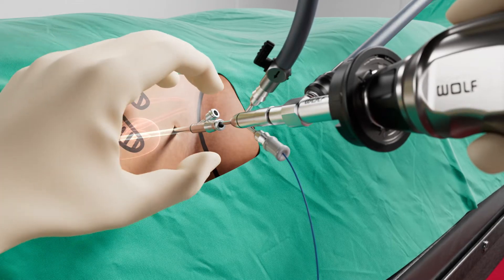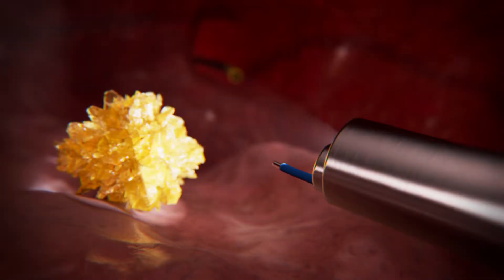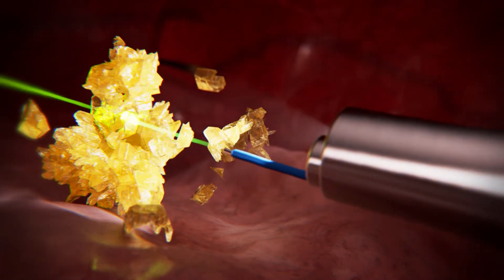A laser fiber is inserted through the laser guide channel. The stone is then fragmented to a size of approximately 1.5 millimeters or less.